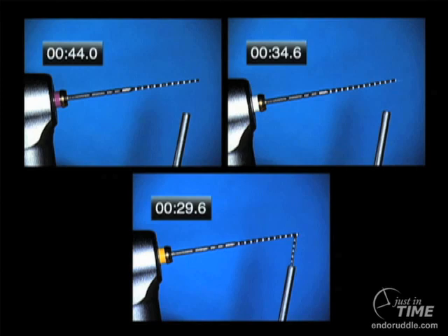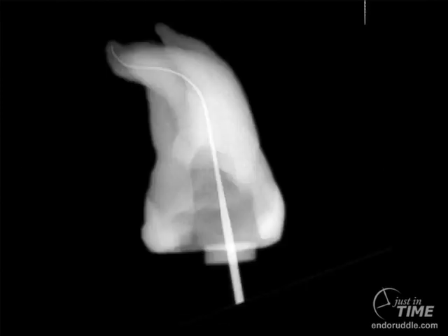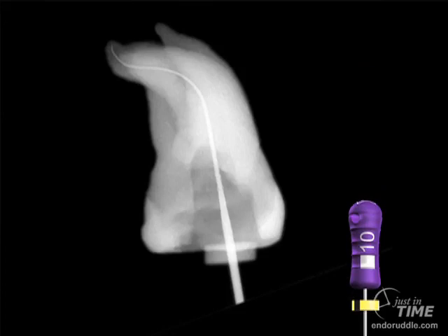Arnaldo Castellucci shared this molar with me. Notice he has opened the tooth and catheterized the canal with a 10 file. Knowing Arnaldo, he has that 10 file loose, and once that 10 file is loose, you can begin to imagine — could we spin three path files through that significant multi-planar curvature?